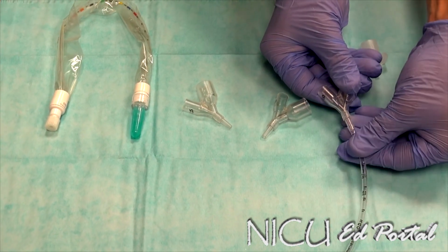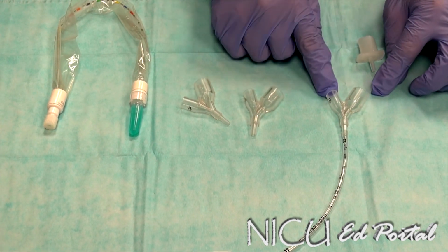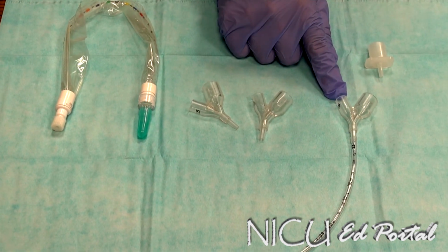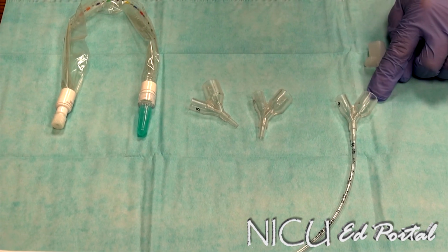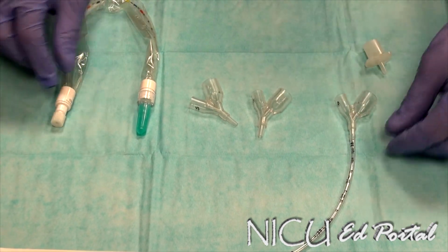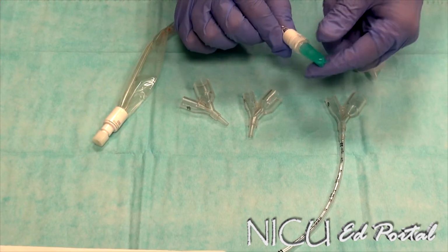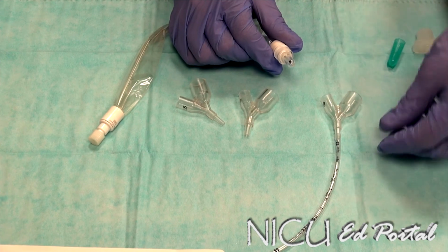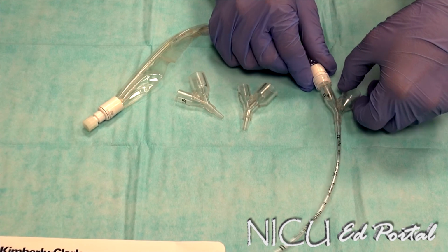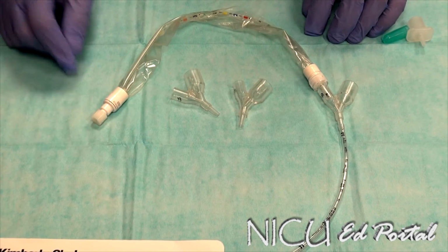You put that where your original adapter was, and then we have the setup here where we have one port for our catheter, this one in front of my finger, and the other port would be for your manual bag or your ventilator circuit. So from here, we take our 5 French catheter, we remove the blue cap, and this catheter goes in the smaller of the 2 ports, which goes like that. And now you are ready to administer your surfactant.